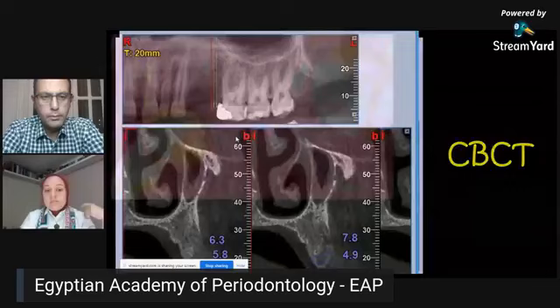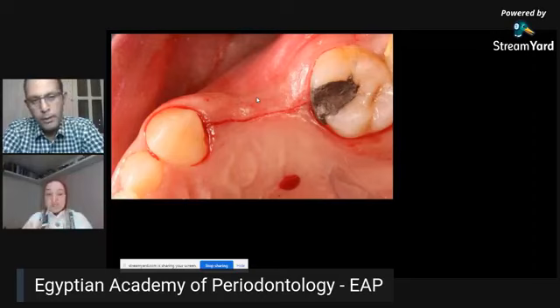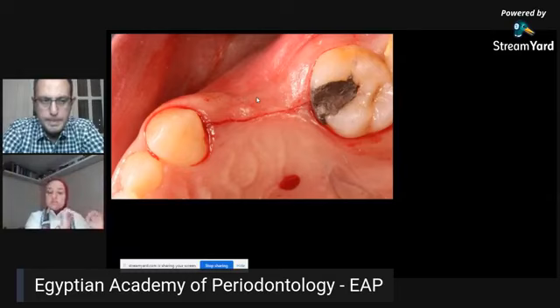And this means that I don't go bone driven. I don't follow the bone. I follow the future crowns. So in this case, we knew that we would have a bone defect buccally, a fenestration or a dehiscence, or maybe just a crack. And we were preparing the xenograft and the collagen membrane on the table to do simultaneous augmentation with those implants. So we started with the full thickness crestal incision regularly.